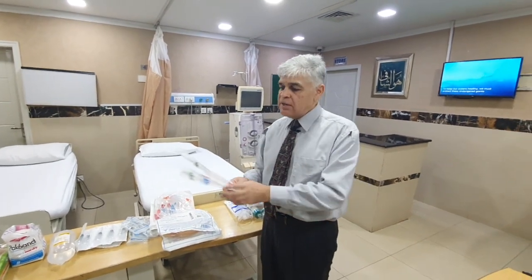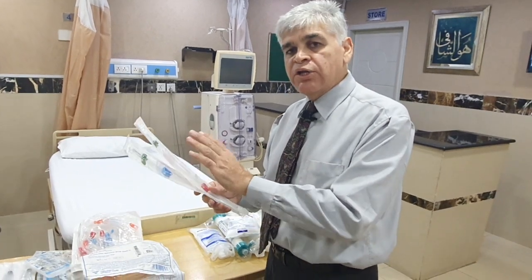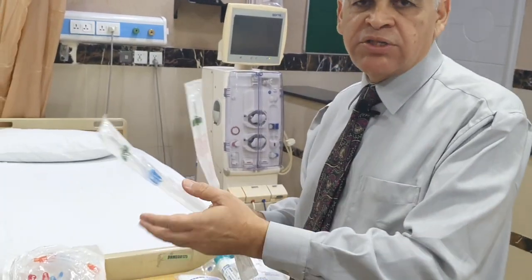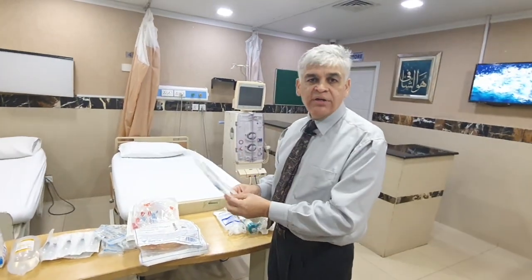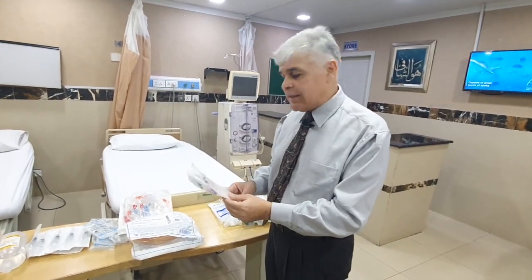So for those people who are going to sit their fellowship or membership examinations, remember that this is a very important thing, that these are three areas where the artery and veins are different. So as far as the dialysis machine is concerned, it's the same thing. The blue one, which is normally venous, actually stands for the good blood, or the oxygenated, or the better blood, and the red one stands for the bad blood, which means the blood which is not clean.